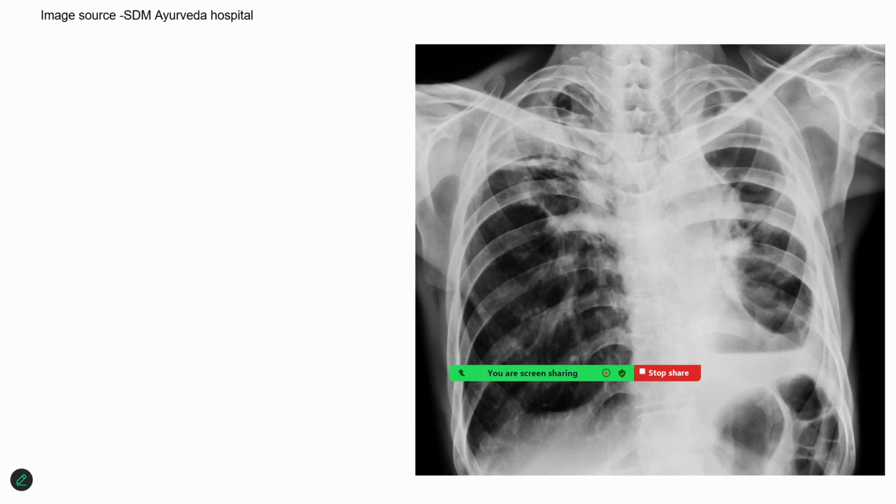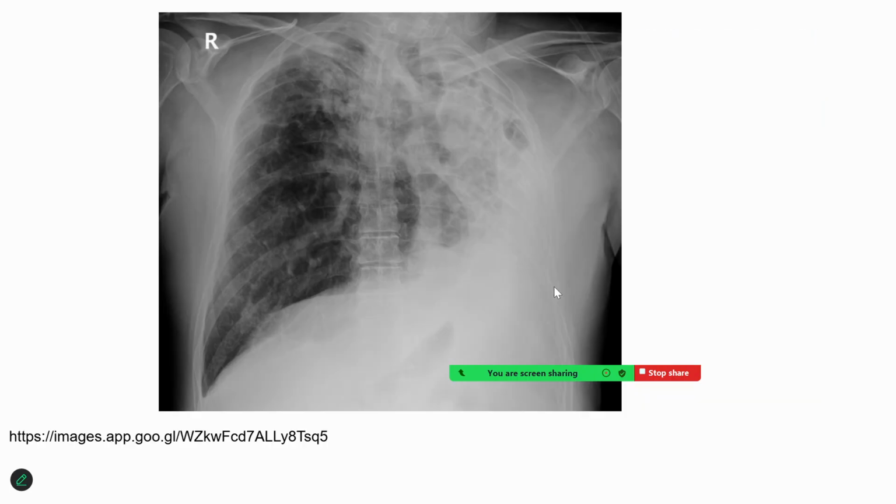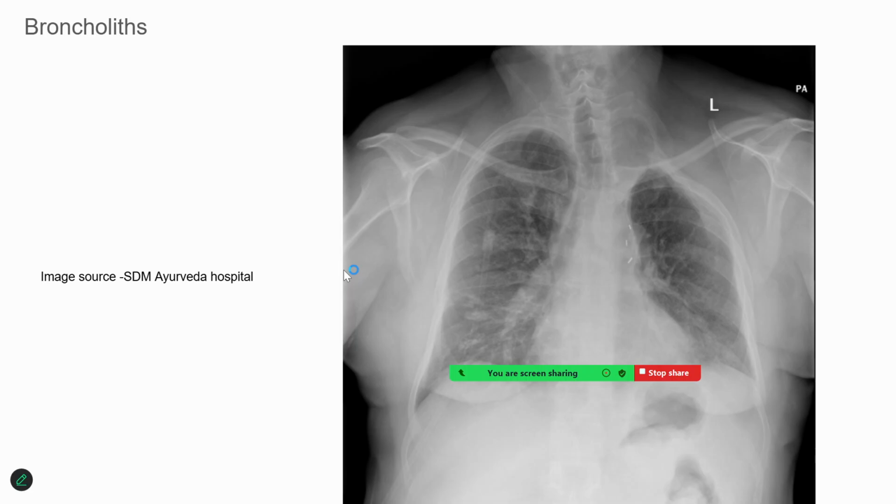Patients may have secondary complications like infective pathology, and bronchiectatic changes could occur. Patients may have a significantly reduced volume of the lung, resulting in dyspnea on exertion, and the patient would really be suffering in such conditions. Tuberculosis also can result in a pneumothorax. Some of these bronchi may become blocked or maybe ruptured, lung tissue may be ruptured, and hence there could be air filling into the pleural space. The whole lung tissue may be displaced to the other side. That kind of change may rarely occur, or it could be a very huge displacement due to the tuberculosis, in extreme cases of that sort.